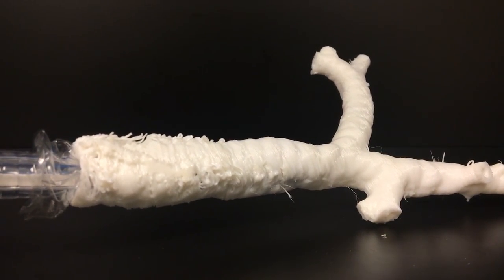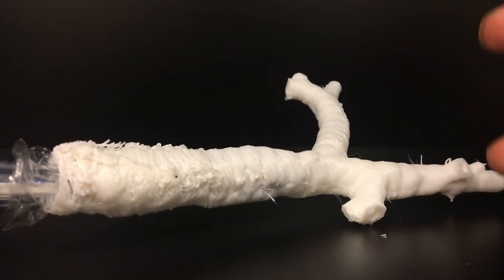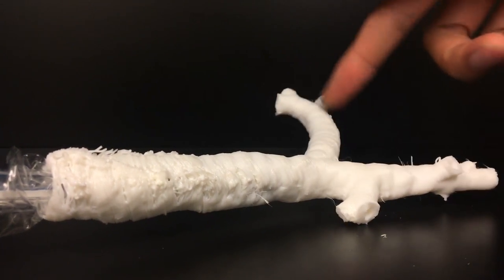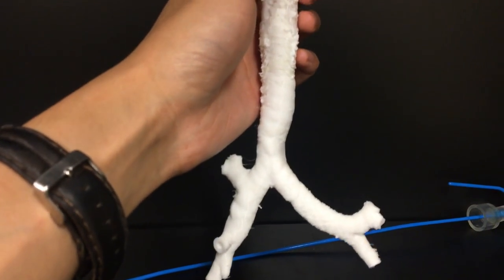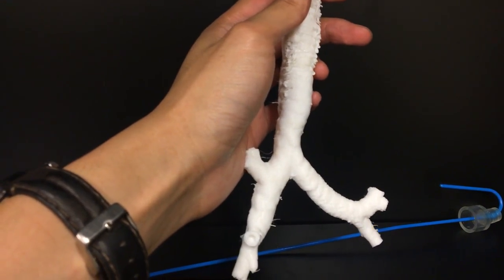Barring that, if you really wanted to use this 37 or 39 or whatever you want higher up, you would go back into your digital model and MeshMixer, and once again change the internal hollowing offset to something like 1 millimeter instead of the 2 that we did. That way you get a much wider bore, and you could actually get a larger bronchoscope down if you just wanted to do a simulation. So once again, the NinjaFlex accommodates a wide range of tube sizes, and it gives you a somewhat realistic flex relative to the cartilage. Not one-to-one, but I mean, it's better than just being a static and hard plastic.